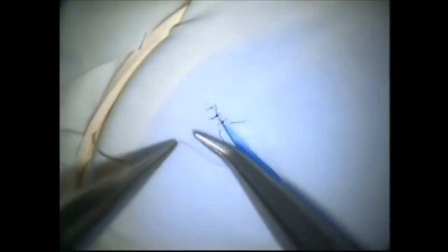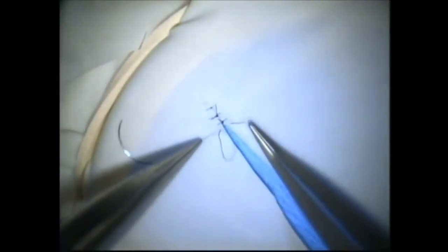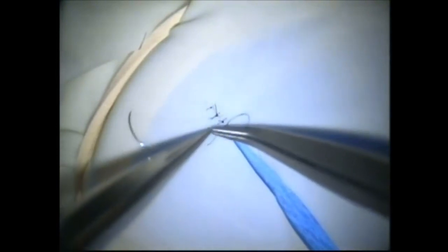Let's go over some of the details of actually grasping the suture end. When we make the loop, we don't want the right-hand instrument all the way over here and then pass it — there's a lot that can go wrong, such as the loop falling off the end of the instrument. Instead, first have the instrument pointing right towards the end of the suture, then make the loop, and all we have to do is open the forceps and grasp it. Same thing on the second throw: have it pointing down, grasp it, and pass it through. On the third throw, grasp it and pass it through.